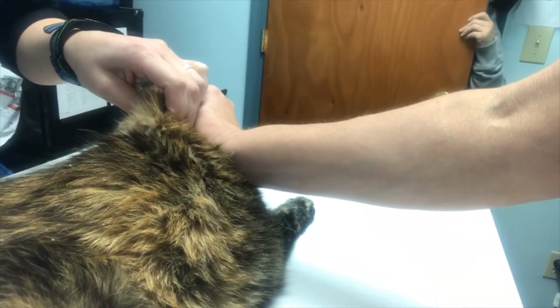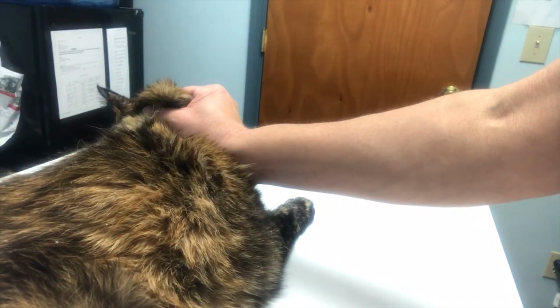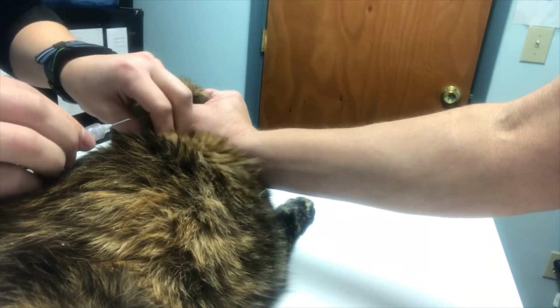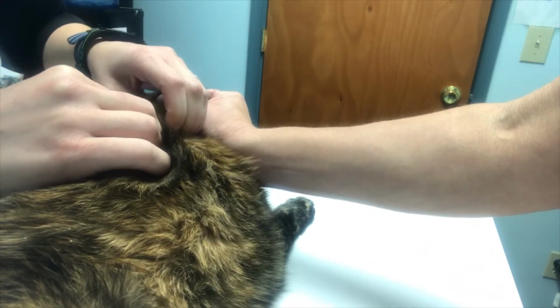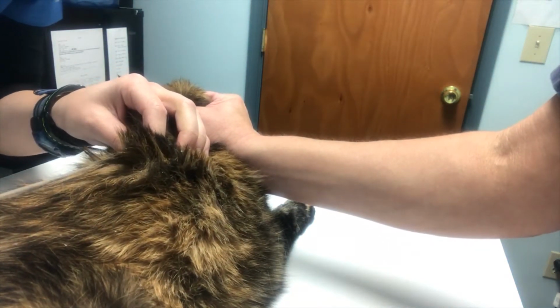You're going to tent the skin gently, and then you'll insert the needle. You want to make sure you don't poke through the skin, because then the fluids will not go under the skin as they're supposed to. So you have to tent the skin, apply pressure until it's through. And I'll keep a hold on the line to ensure it doesn't move as we are giving the fluids.